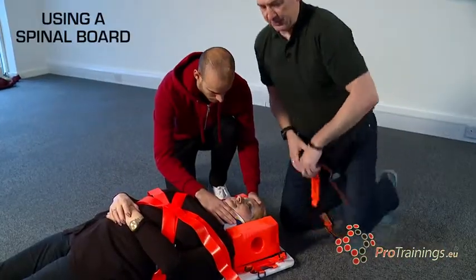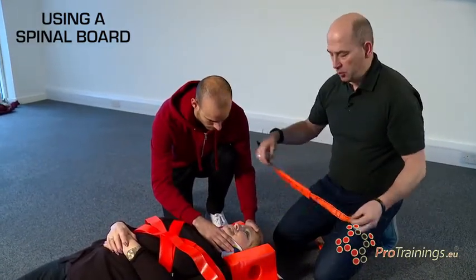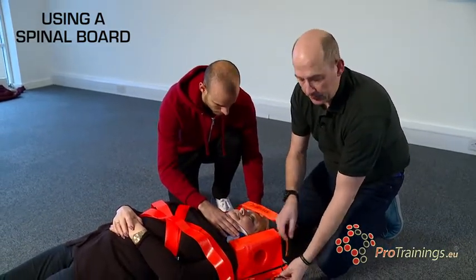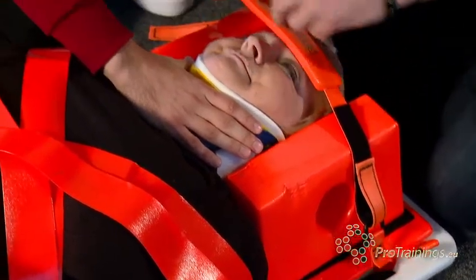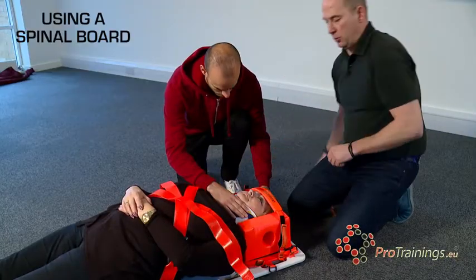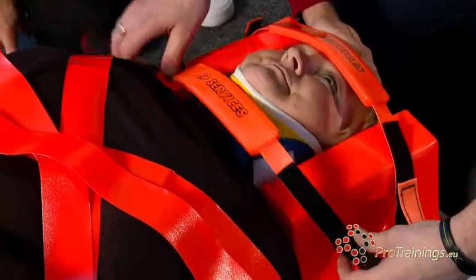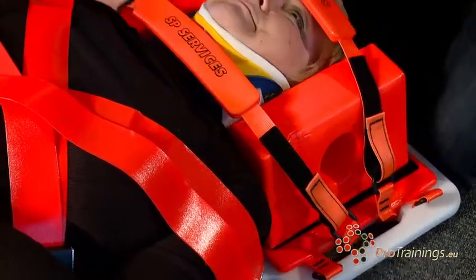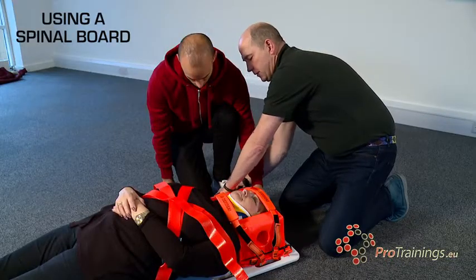Once the velcro is placed and fixed, we apply the straps — it's not until the straps are applied that we can release hand pressure. We go for the second loop down, loop through and come back on itself, and do the same on the opposite side. We then come underneath the chin with the second strap — you can let go of the chin — going the second loop up and velcro on both sides.